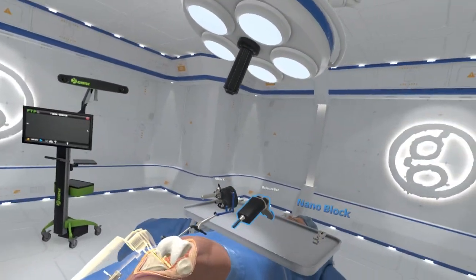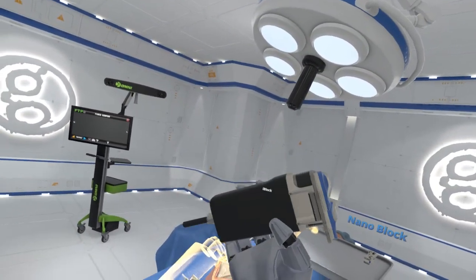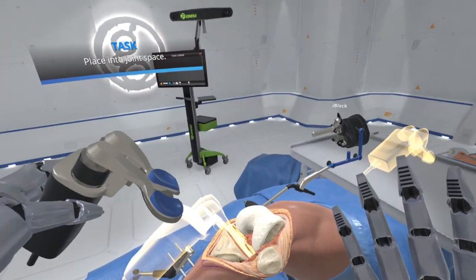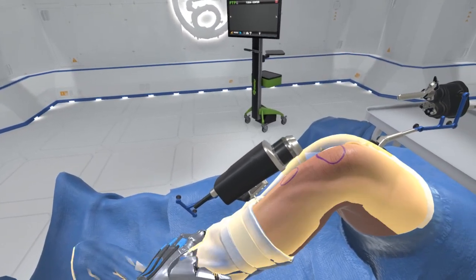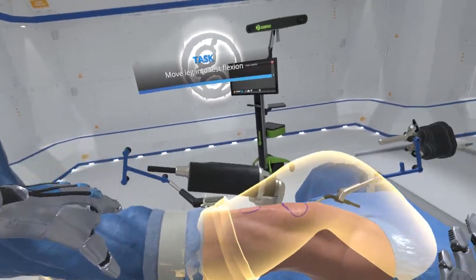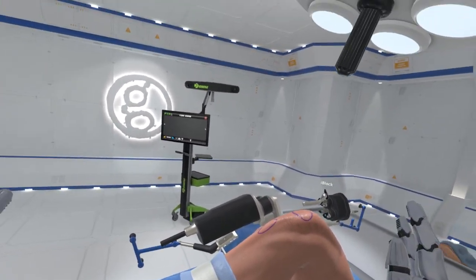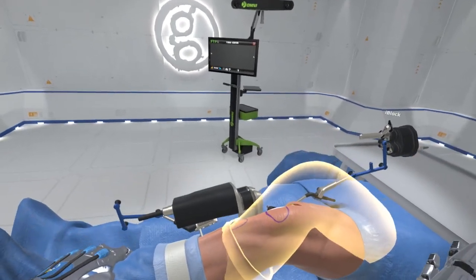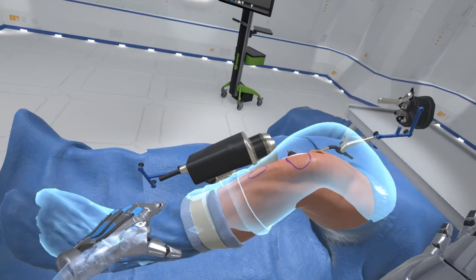Select the balance bot. Install by inserting the robotic paddles into the joint space on the resected tibia. Grasp the ankle and manipulate the leg into full extension and maneuver the leg through a complete range of motion to get quantitative data on the knee. You may repeat as needed for complete data acquisition. When complete data acquisition is achieved, return the knee to 90 degrees of flexion on the surgical table.